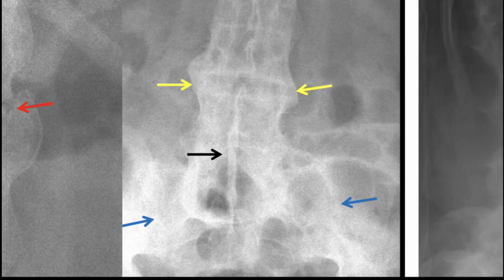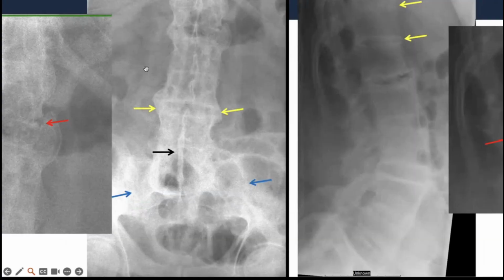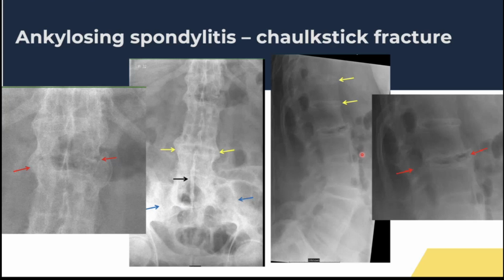The other thing to mention, when you're doing radiographs, and this is probably more for radiologists, but you're all budding radiologists, is something called satisfaction of search. So you'll finish looking at your X-ray or your CT or your MRI, and you'll find one or two significant findings, and you'll think that's finished. I'm done with this, but actually there's more to look at, and you have to always be systematic, and it doesn't matter what your system is. This is so cliched, and I can't believe I'm saying this now, having had this said to me so many times before. But you have to really stick to your system.